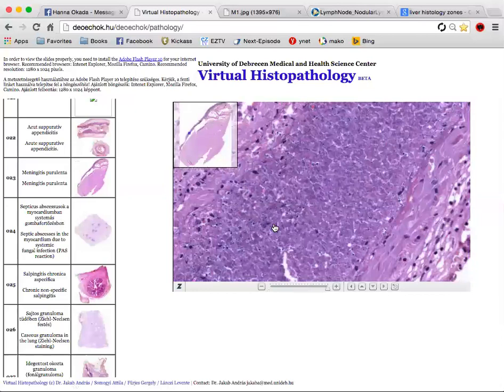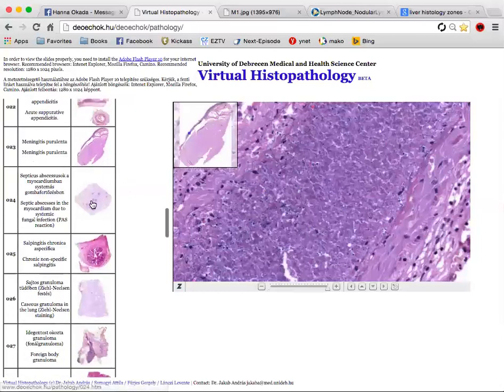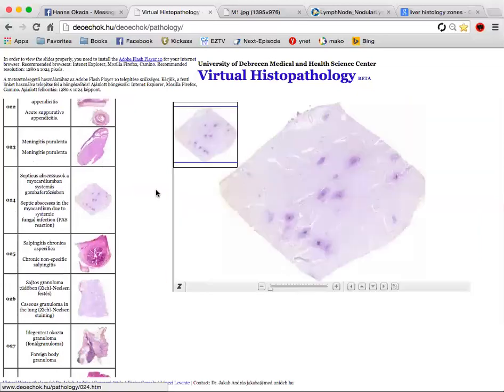You cannot know what caused this just from looking at the slide. So you're going to need to do a lumbar puncture and culture it, maybe send it to do some immunological methods, but you can't know what caused this. You can say that it might have been bacterial infection just because it's purulent. All right. So next up.